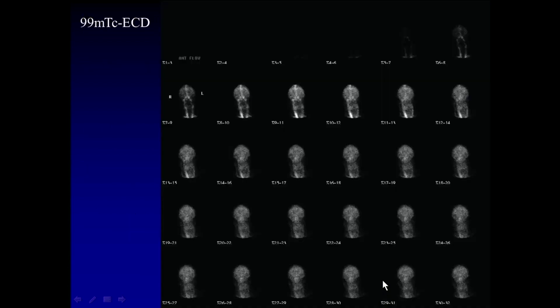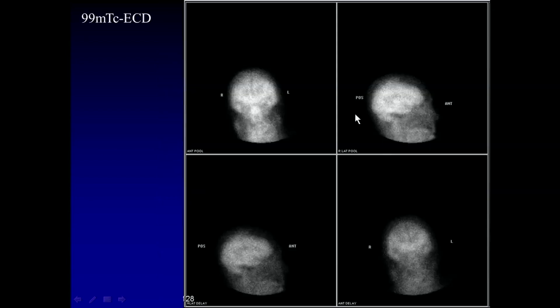Here's an example of a dynamic flow scan with ethylene cysteine dimer — it's an anterior view, injecting it like a poor man's contrast. You can see the carotid and the anterior cerebral artery. If there is perfusion to the brain tissue, you'll see activity binding to the brain tissue, and you can do multiple static image views to see the distribution in the brain. This was a study for evaluation of brain death — if you see activity like this, that means there's still blood flow and you cannot call this patient brain dead.